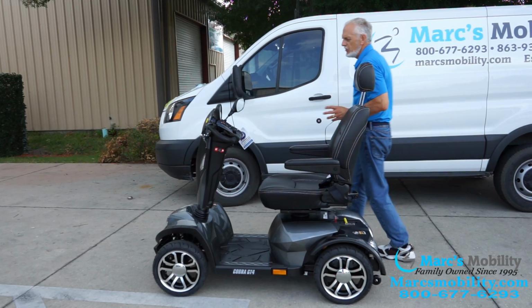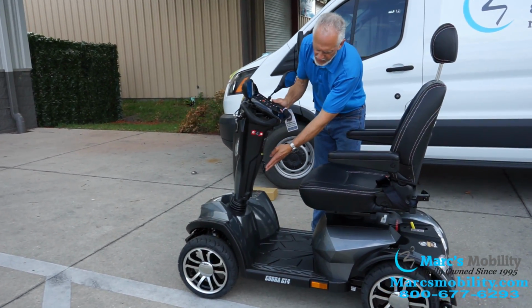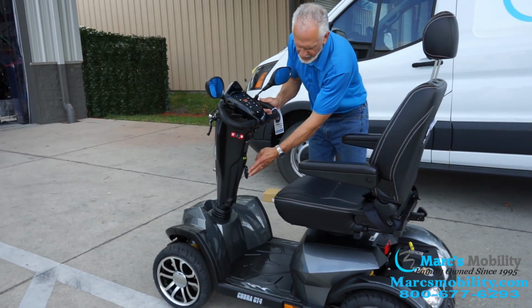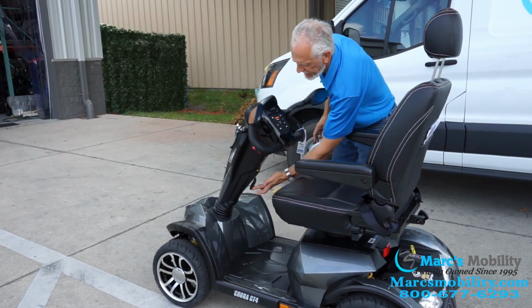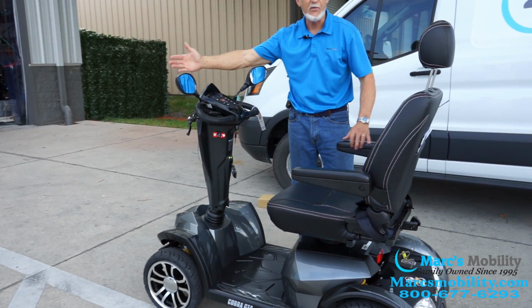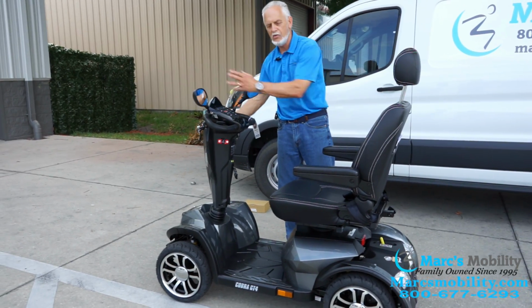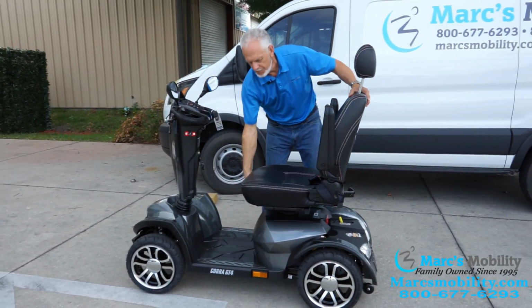This is called your tiller right here, your tiller assembly. It's adjustable with this little knob right here. If I push this, I can go down. And if I push it again, you see how easy it comes up? This is as far as it'll go up. So some of you want to know how far it will go. You can see right now, this is as far as it'll go.